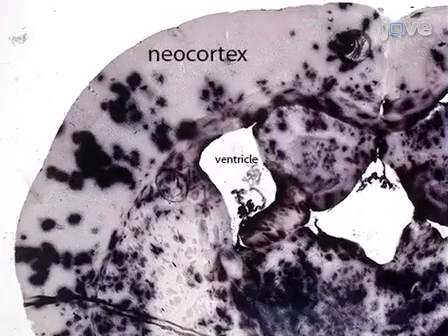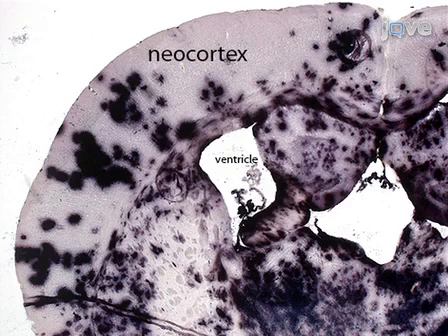Ultimately, results can be obtained that show the location and phenotypic characteristics of infected cells through detection of a given reporter gene in tissue sections and labeling with cell type specific markers.